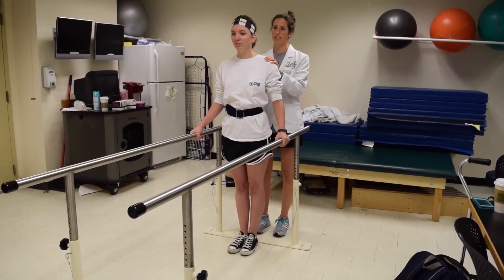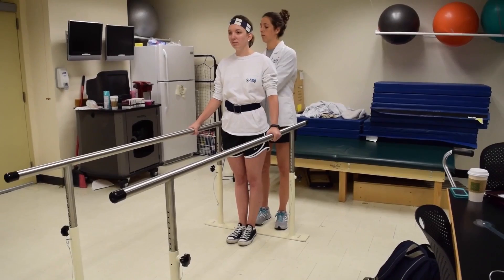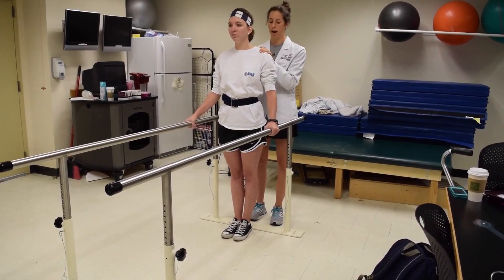Back to center. The next step we're going to take is just one at a time — you're going to lift your left arm up in the air, take that off the bar for a count of five, and then place that hand firmly back down on the bar and lift the right side up.